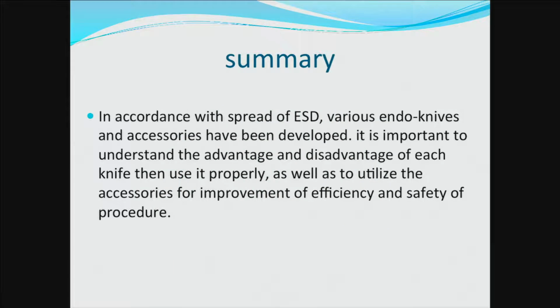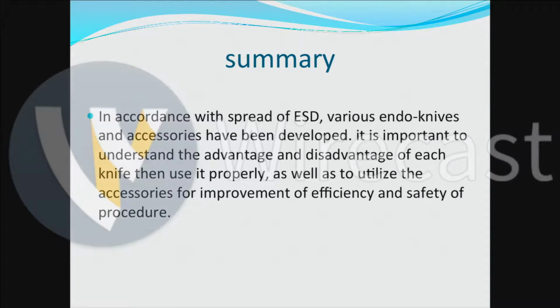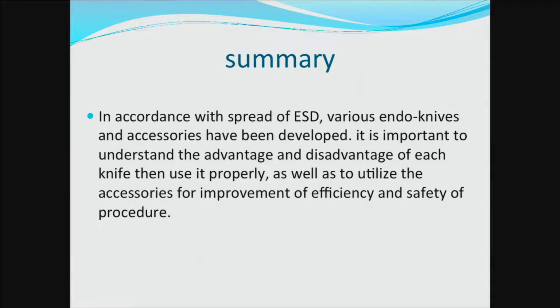And this is a summary. In accordance with the widespread use of ESD, various knives and accessories have been developed. It is important to understand the advantages and disadvantages of each knife, then use it properly, as well as to utilize the accessories for improvement of the efficiency and safety of the procedure. Thank you for your attention again.